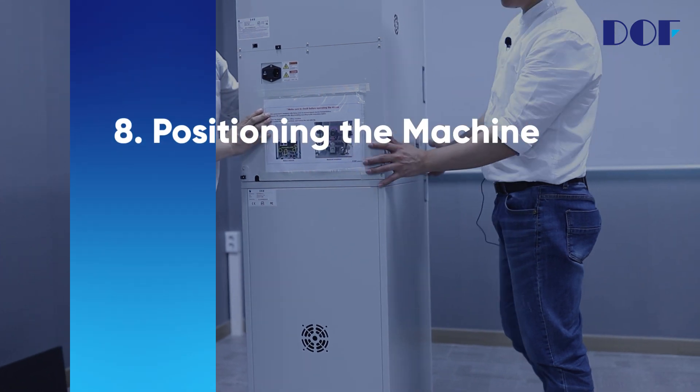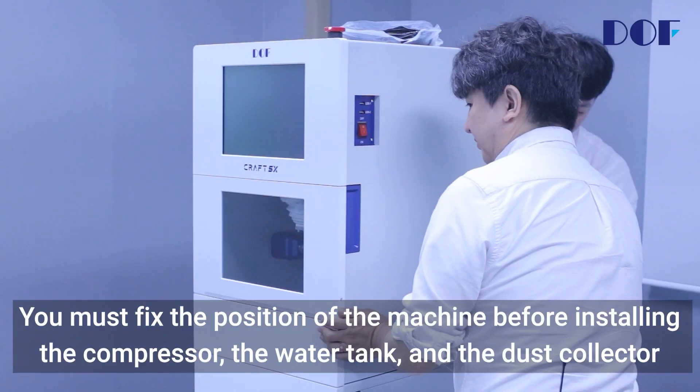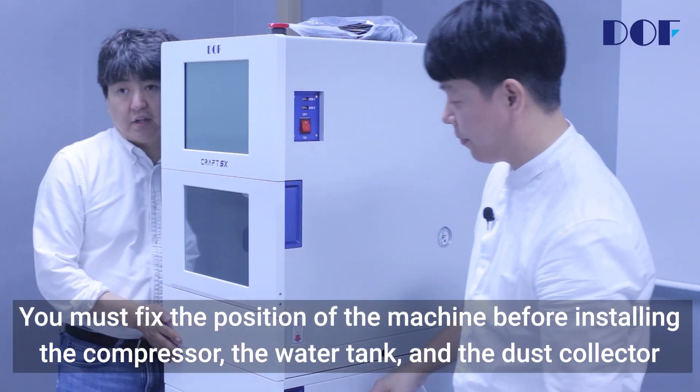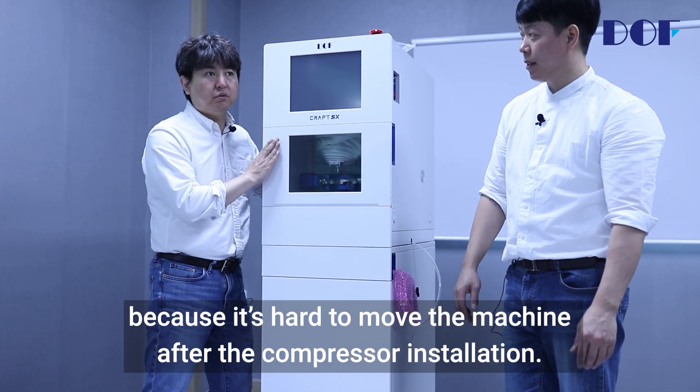Positioning the machine. Turn the machine and set the position. You must fix the position of the machine before installing the compressor, the water tank, and the dust collector, because it's hard to move the machine after the compressor installation.